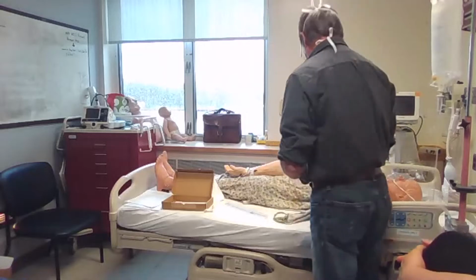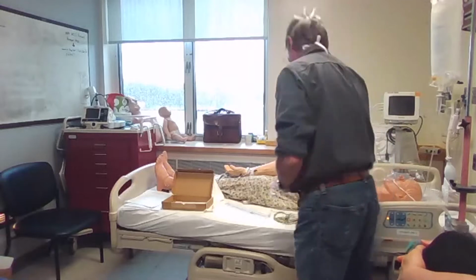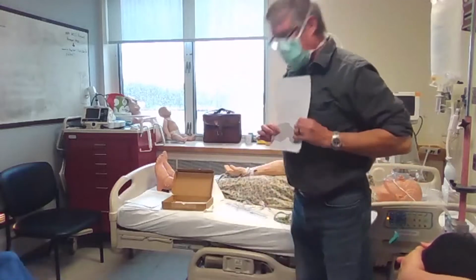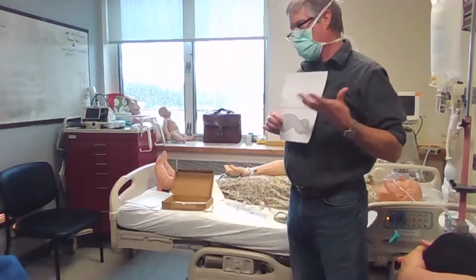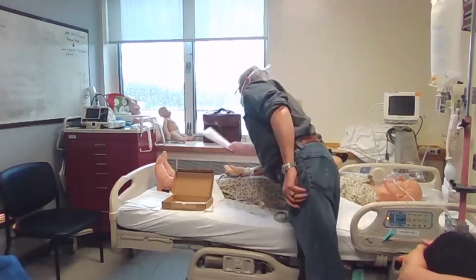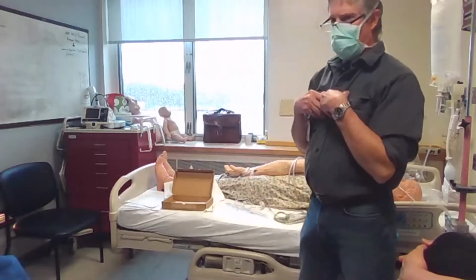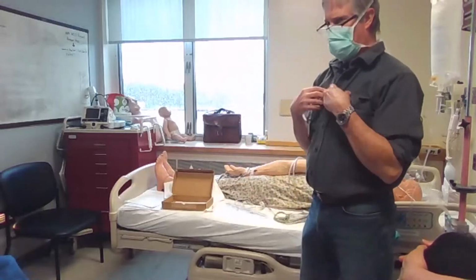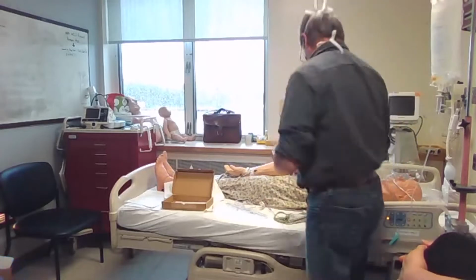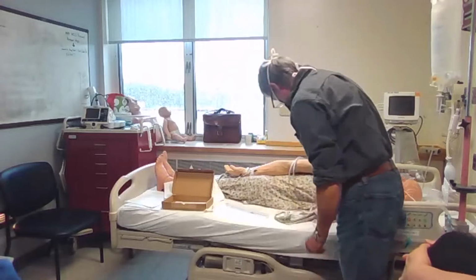So in cardiac surgery, we use what's called the phlebostatic axis, which is a point in the body, which is basically where the heart sits. In cardiac surgery, you're worried about all the blood flow to the heart. What we're most interested in is cardiac perfusion pressure, so how much blood pressure it takes for the arteries in the heart to get blood off of the aorta. So you set it up to that area right there.